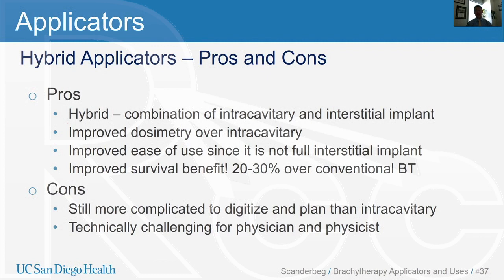It's technically easier for the physician and physicist than a full interstitial implant. However, it is still complicated and technically more challenging than a straight intracavitary implant, because you are inserting a few needles.